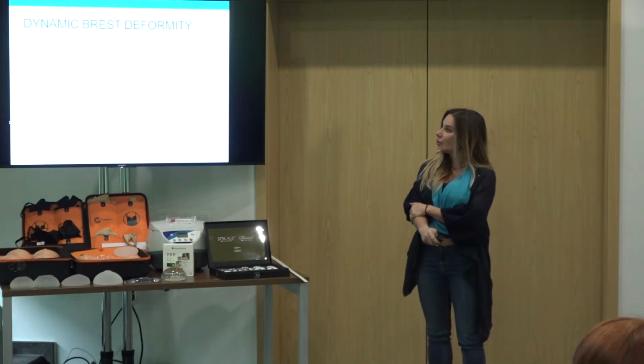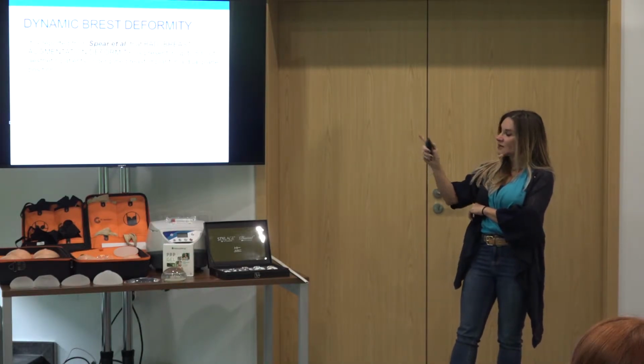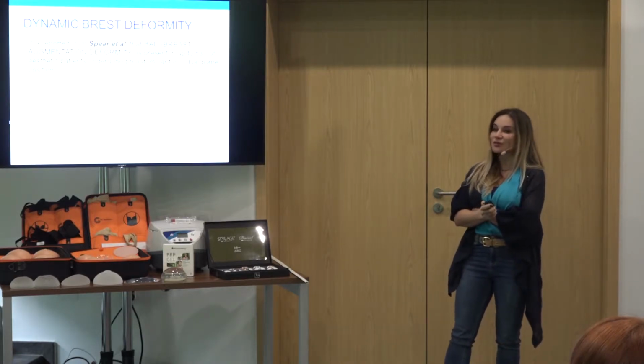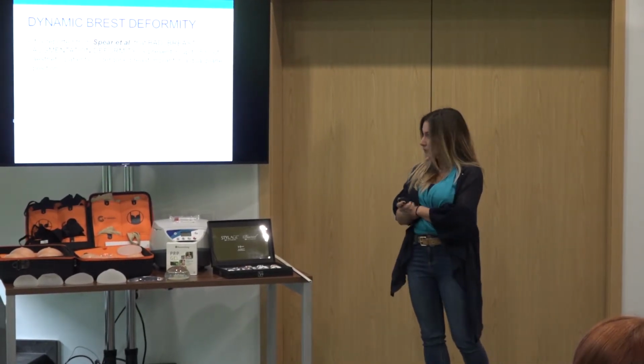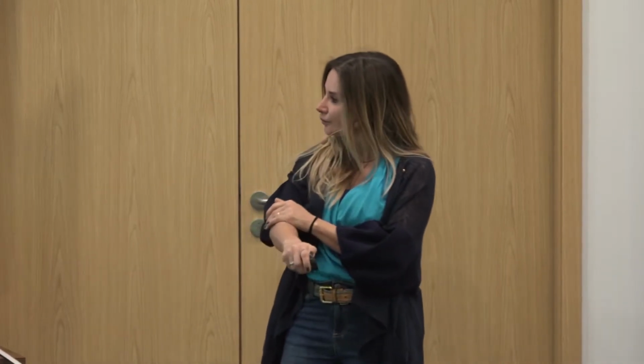So many patients do not complain about that, but some others now are really understanding this problem and want it to be corrected. So what we know from the literature, reported by Spears, is that this deformity is present in 53% of the aesthetically performed breast implants, but is even worse in the reconstructive ones, 75.6%. So it's a very high incidence with the regular dual plane and submuscular surgery. It is considered not only cosmetically, but also from a medical point of view, because some of these patients complain that they have pain during the contraction because of this dynamic deformity.